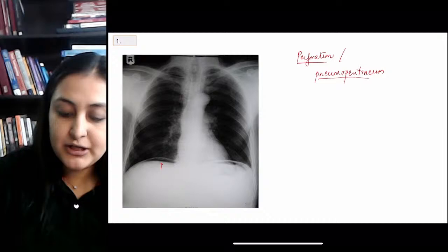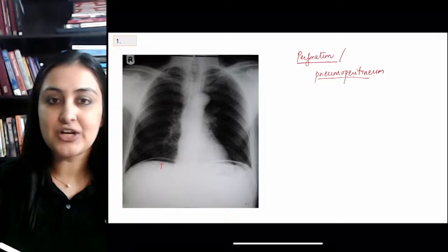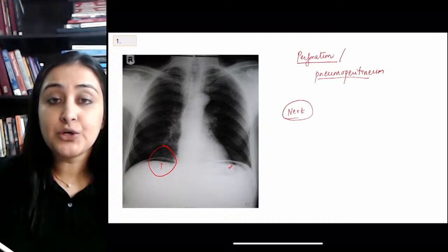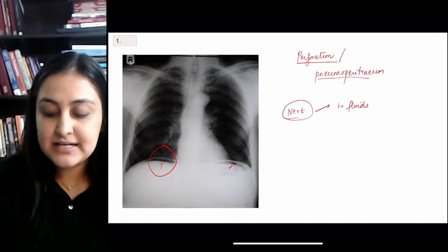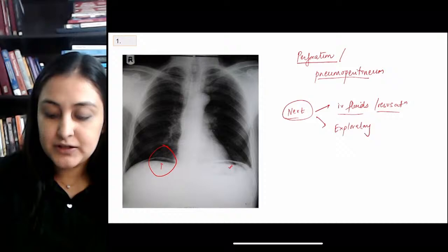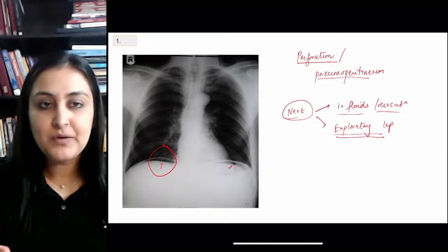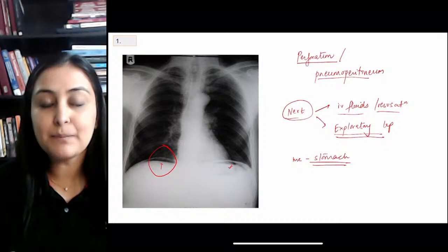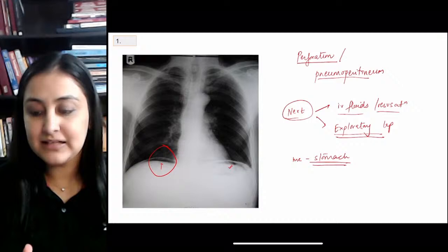Look under the right diaphragm, not the left, because the fundus gives normal air on the left. When asked what to do next: if IV fluids or resuscitation is in the options, go for that first — never refuse resuscitation. Eventually, once the patient is stabilized, management is exploratory laparotomy. The most common organ to perforate is the stomach — patient may have a history of peptic ulcer or NSAID use.